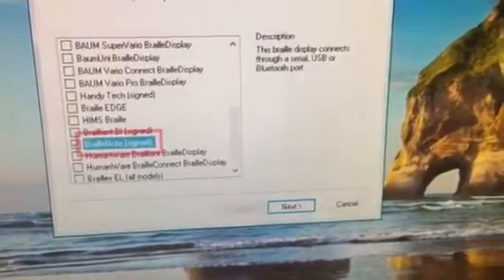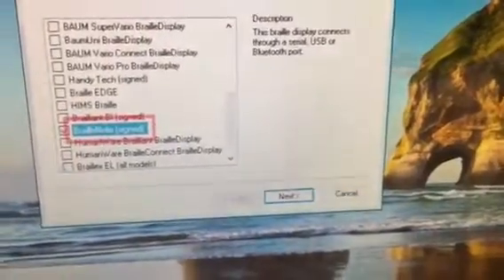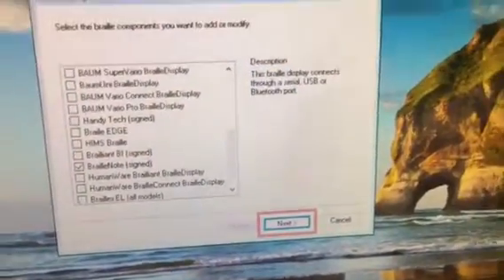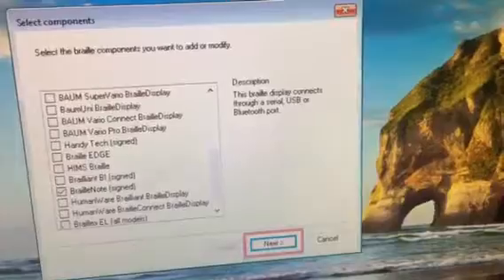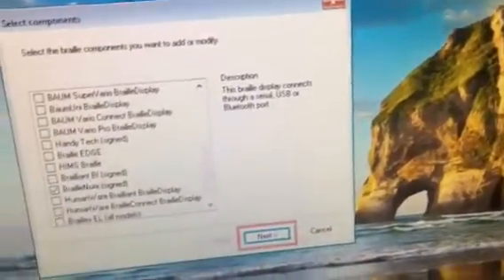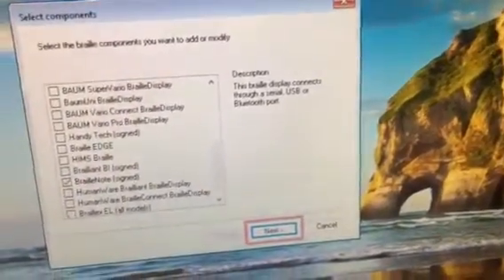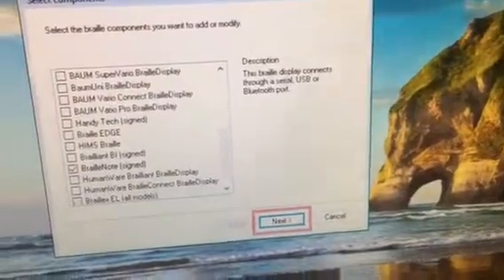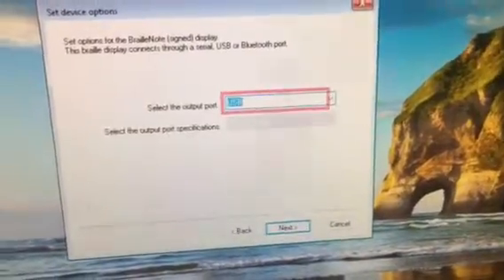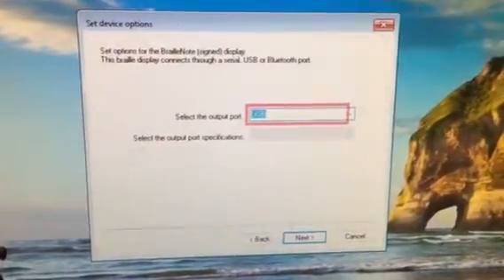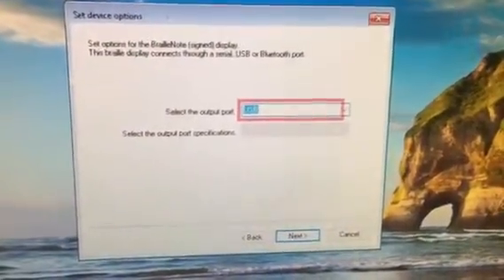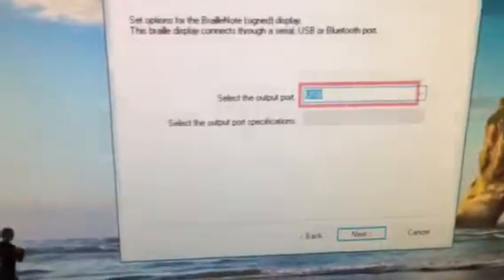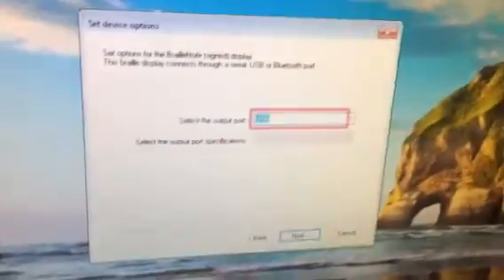Then you'll press the spacebar to check and make sure that it's checked. Then you're going to tab to the Next button and press spacebar to activate it. Set options for the BrailleNote display. This Braille display connects through a serial, USB, or Bluetooth port. Select the output port.